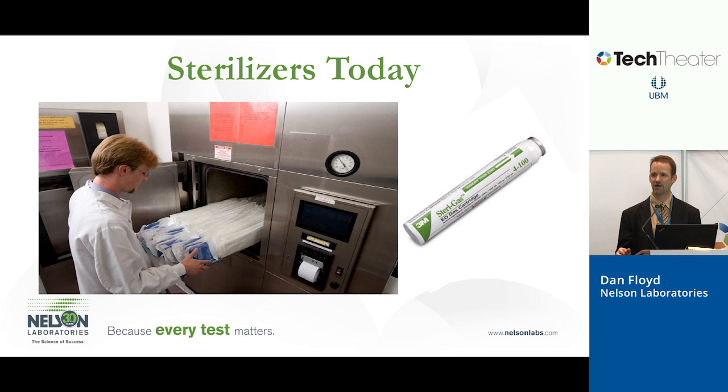Obviously today, much more complex. If you stop by 3M's booth, they have one of their sterilizers, same one that's in that picture, that has a lot of functions as far as programmability. You can program almost anything you want to, how fast the gas adds, how fast the vacuums go. So all computer controlled, and so very, very obviously much more complex, and the process has really been optimized a lot since those early days.